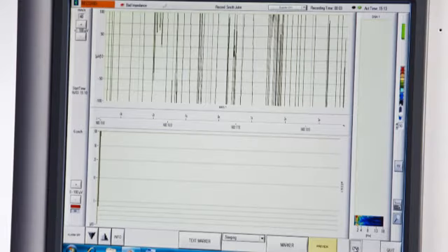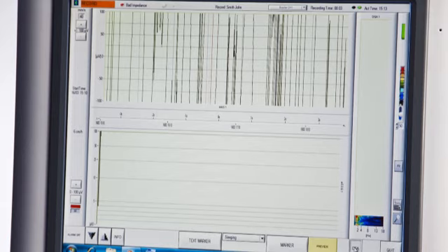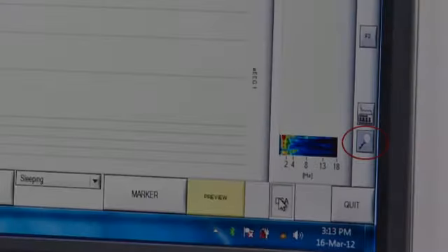Once the problem is rectified and the AEEG or impedance falls below the alarm threshold, then the alarm will stop.